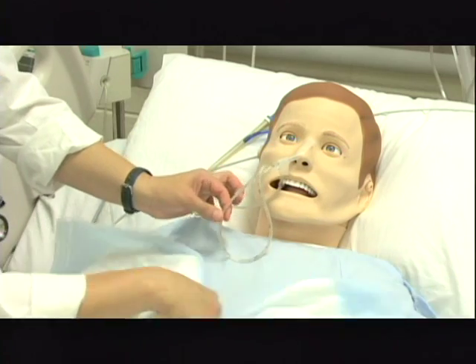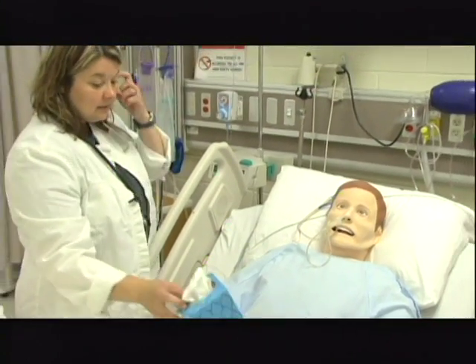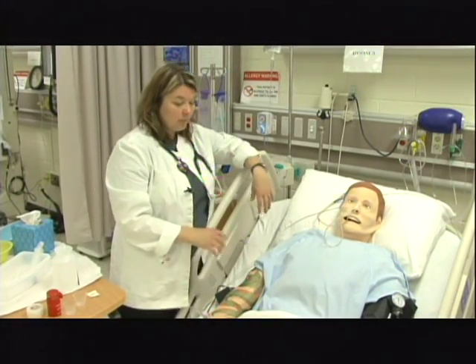Without pulling on him, I'm going to go ahead and get the waterproof drape off of him, and I would come back and dispose of it appropriately. If he didn't need the tissues or the emesis basin anymore, then I would go ahead and clean all that up. I need to go ahead and make sure that he's in a proper position.